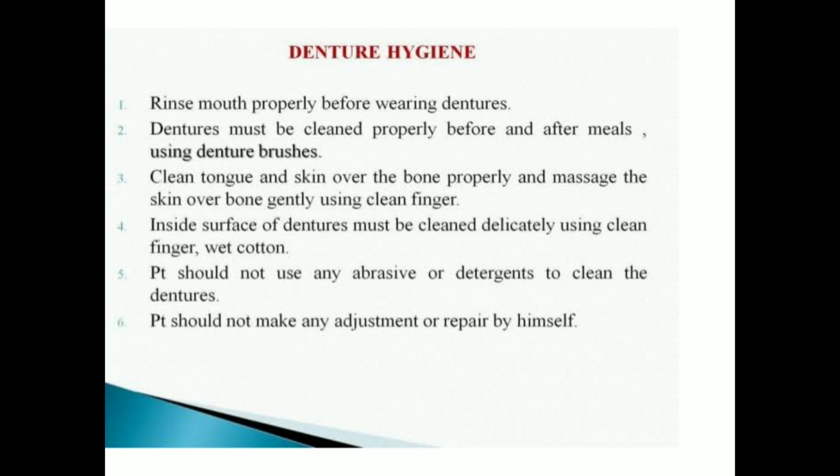You should ask the patient to clean the denture every time after a meal, whether it is breakfast, lunch or dinner. Ask them to clean the tongue and all the surfaces of the ridges, and if possible massage the tissues, gums and everything, right? And you should insist that the patient not repair the denture by himself.